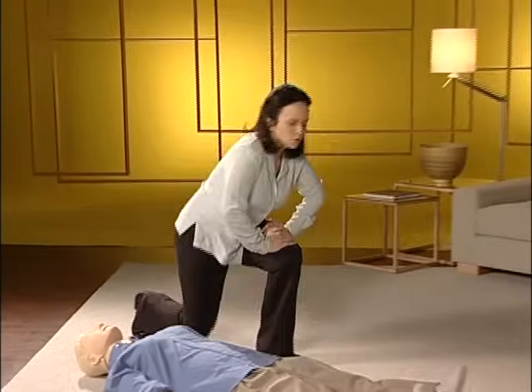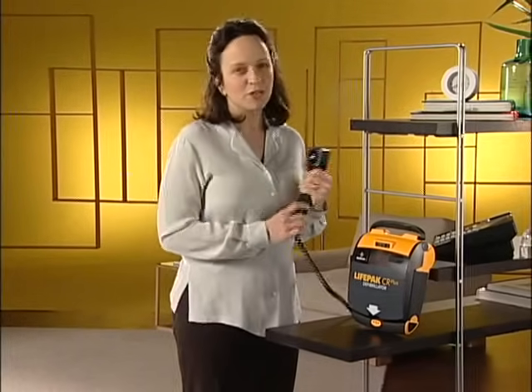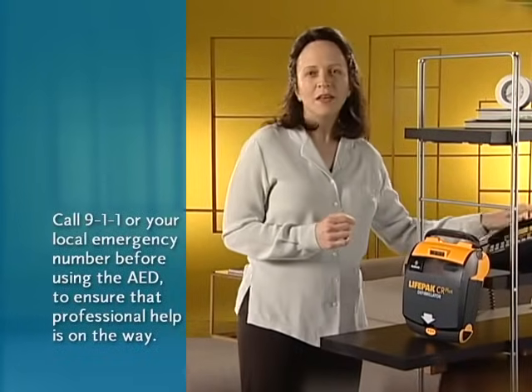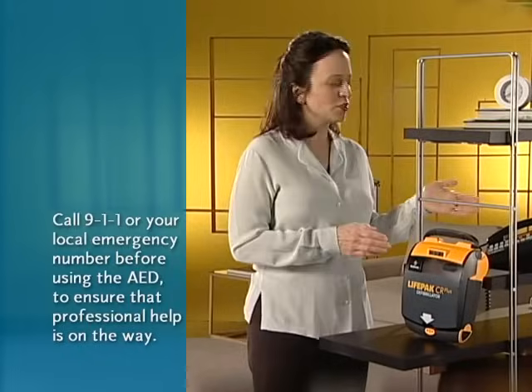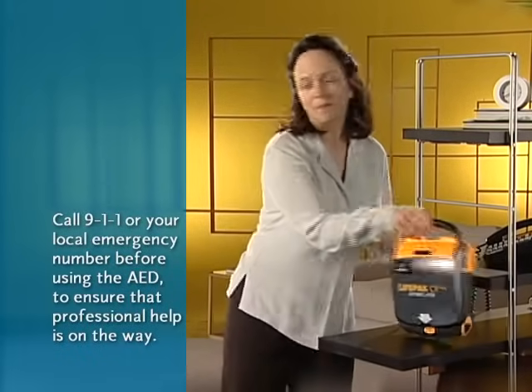If you can't get them to wake up, call 911 immediately, even if you're not sure they're in cardiac arrest. Tell the dispatcher that someone has collapsed and you can't wake them. Tell them you have an AED. Now go get it. If someone else is with you, one of you should call 911 and get the AED while the other starts CPR.